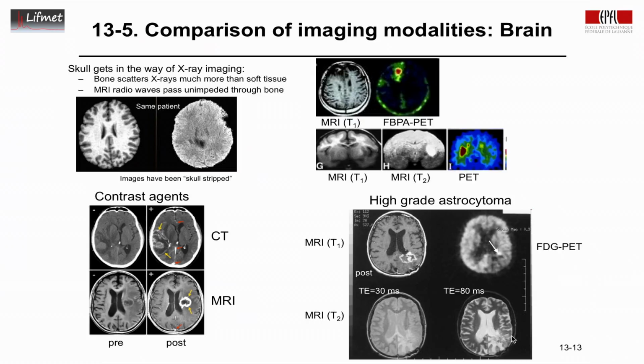The rest that shows up bright on the T2 weighted image, hyperintense, like I said, is a reduction of the relative presence of membranes and so on, and is most likely a reflection of edema. So it's peritumoral edema that creates the increase in T2 in this image, most likely. So the arrow here highlights the area where one would go for, say, surgical or radiotherapy treatment.